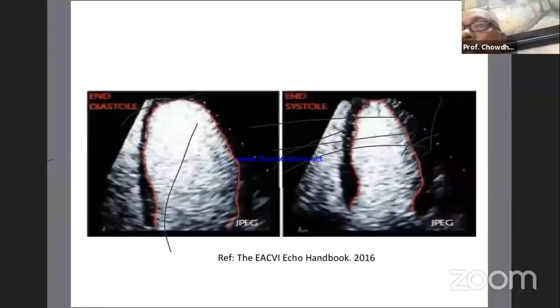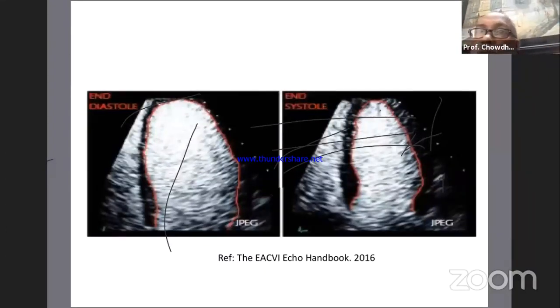So this is the picture of contrast enhancement of the left ventricle, which can delineate the endocardial border, and the trabeculae is included within this contrast material. This contrast material is available. These are commercially made agents, which are injected through the intravenous route, and are not that costly.